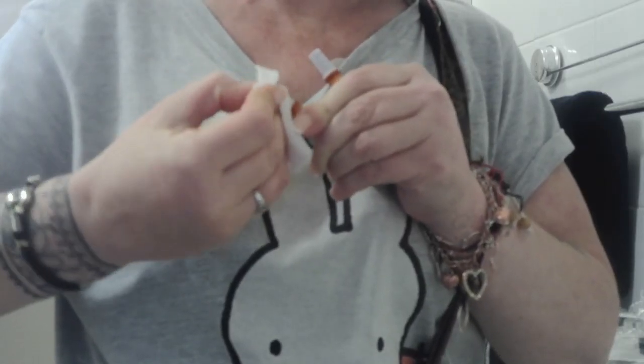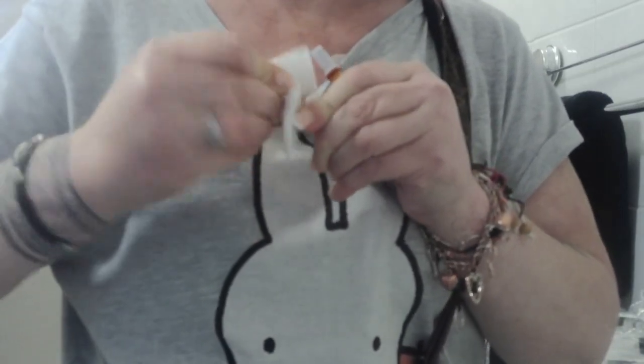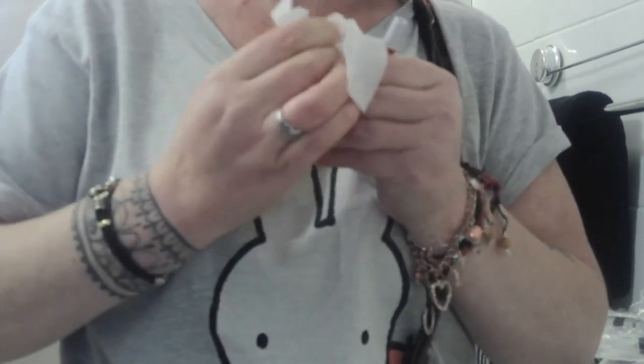So one more pre-clean. Being a bit of a baby, I put my flushes there while I'm pre-cleaning, and then they warm up a little bit, because it is so cold when that goes through your chest. These have to be so clean. You do not want an infection in this.